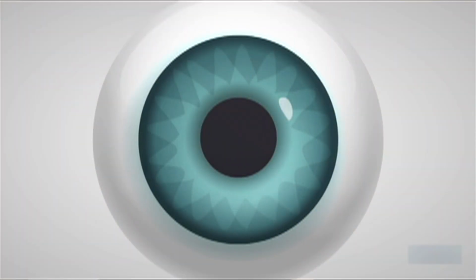So when we see a patient with a cataract, we remove their cloudy lens and we replace it with an implant. So the single most important part of cataract surgery is really the lens implant. That's what they're going to see with forever. And so that's why I like to change the story and have the patient not think of this as cataract surgery, but rather have them think of it as lens replacement.